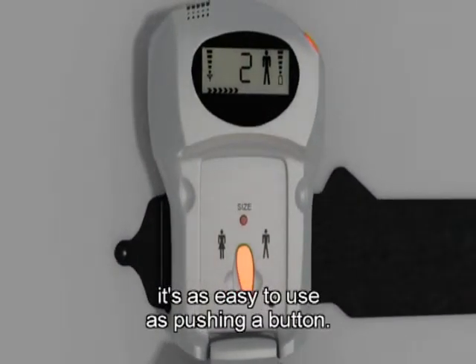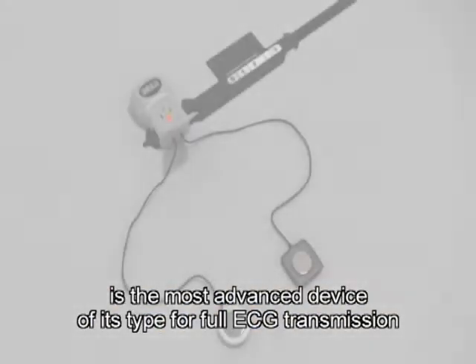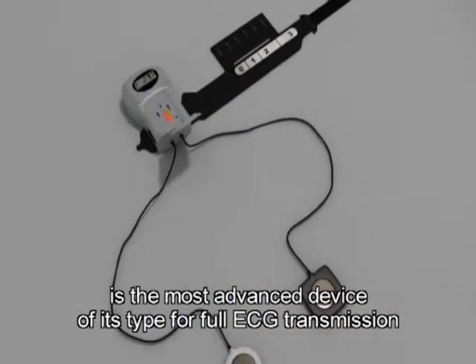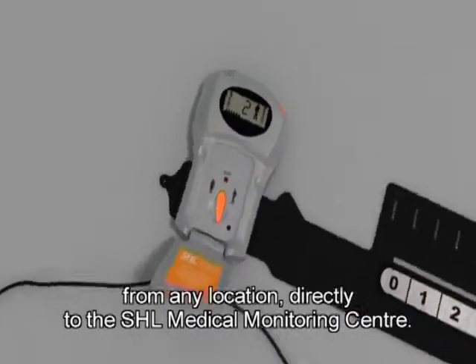It's as easy to use as pushing a button. The CardioSensi, an exclusive SHL development, is the most advanced device of its type for full ECG transmission from any location directly to the SHL Medical Monitoring Centre.